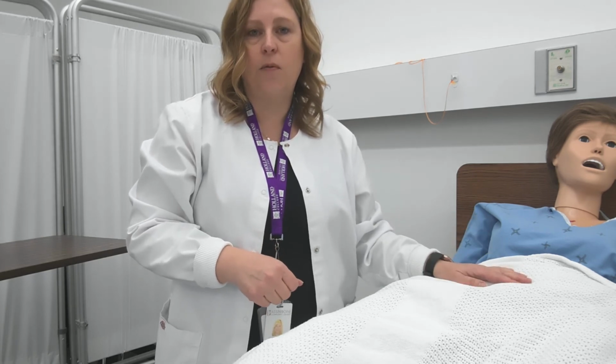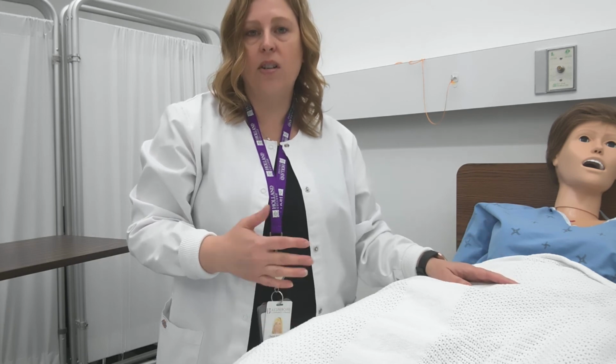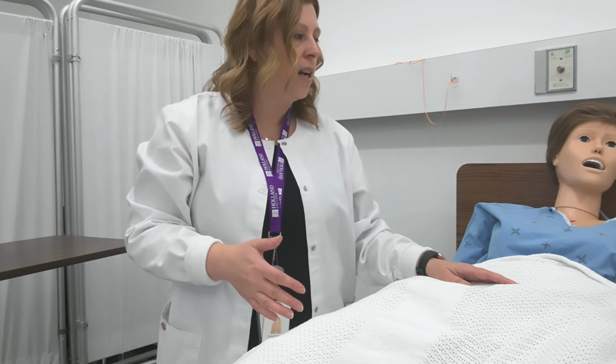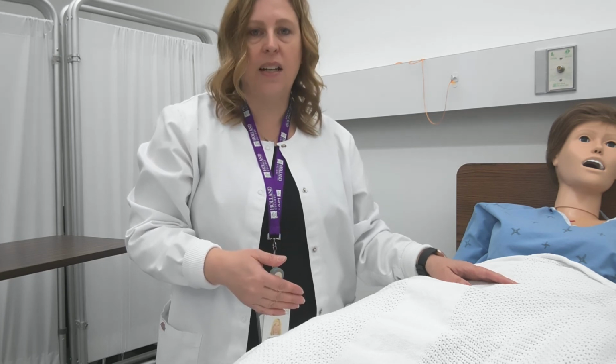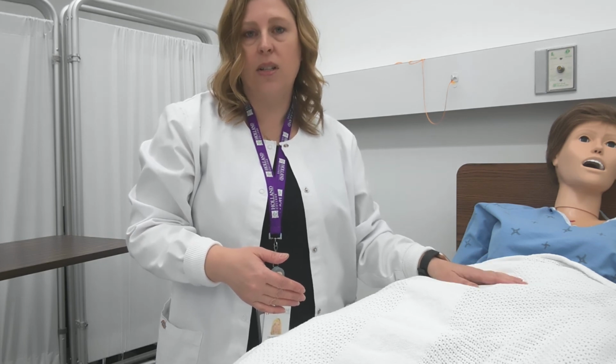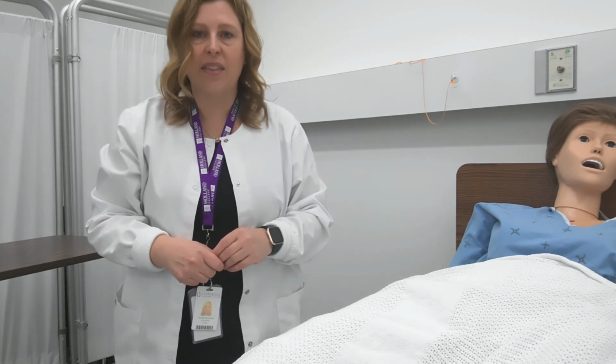If my client hasn't voided within 8 hours, I need to start looking at more interventions in terms of what I can do. If they haven't voided in that 8-hour span, how much fluid did they take in? I'd be doing an assessment of the abdomen, and possibly I would need to reinsert the catheter again. So that concludes catheter removal.